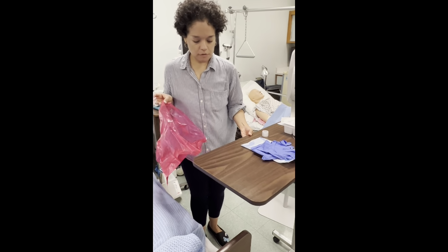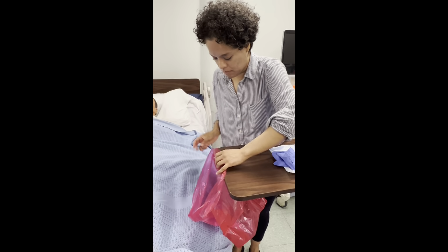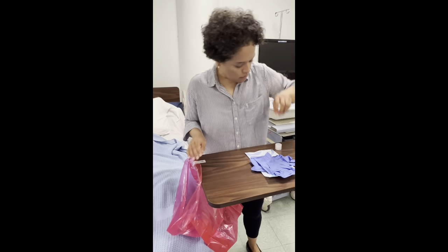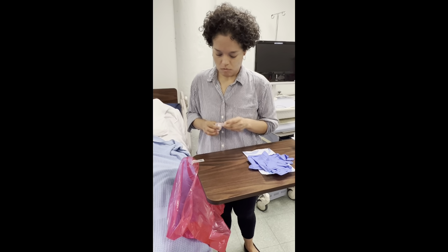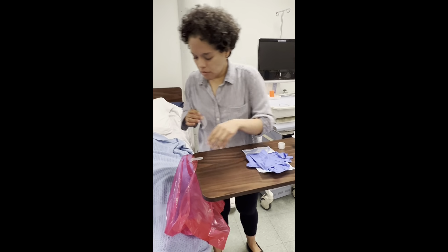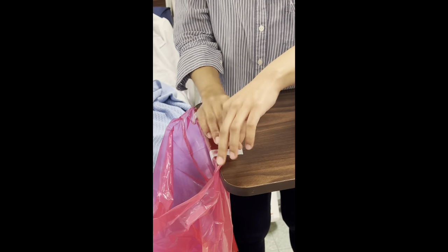Going to bring myself closer and the table as well. One more. Make sure that the bag and the tape is well adhered to the table.